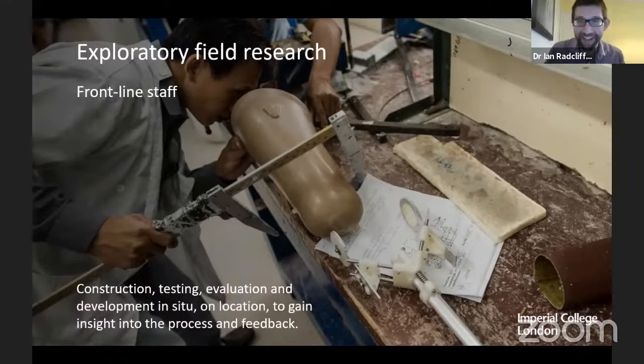So I'll say hi, Cicely, and a big hello to the team out there who I know have been struggling with the flooding and the aftermath of the floods. The P&O team and the technical team there have been instrumental in supporting these projects. We've been combining the polypropylene molding techniques that they've been using with rapid prototyping tools such as 3D printing, so we can test and evaluate new concepts. The team are amazing, and the wealth of experience that they bring to these projects is essential in order to make sure that the process is helping to develop appropriate solutions.